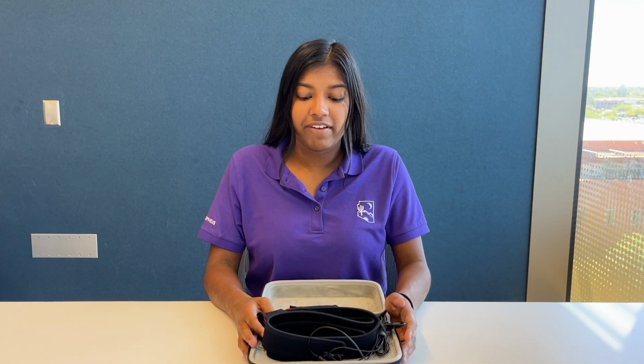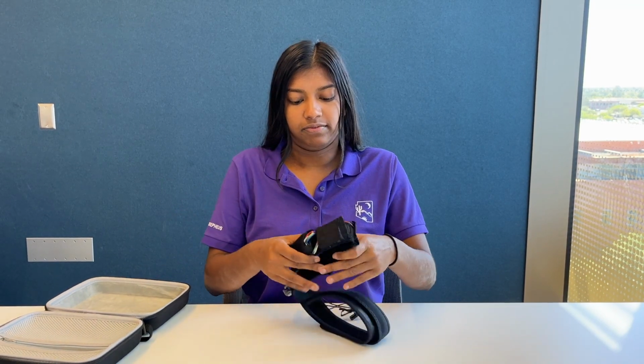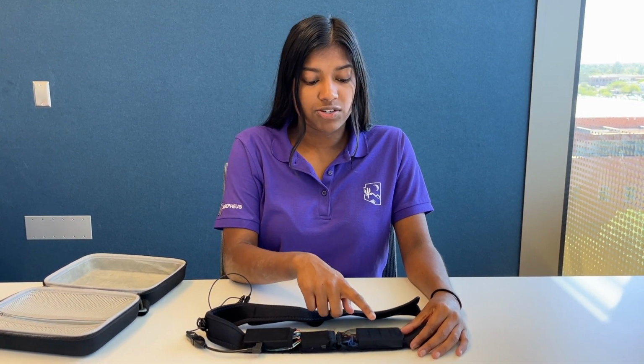Within the device, we find the 3 unique casings that help Snorpheus performance function. First, the Raspberry Pi microcontroller right here is connected to the microphone for audio recording. Second, the IMU is housed in this casing for positional recording. Lastly, the battery is stored in this casing to fuel the device throughout the night. Each of these pockets is hand-sewn onto the strap and secured with Velcro to ensure the data recording is consistent for a patient's full night's sleep.